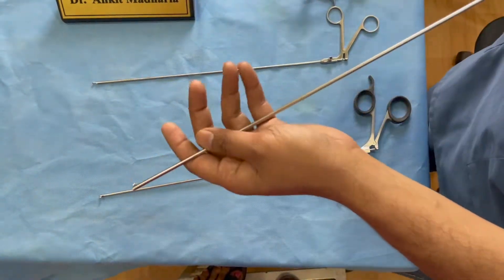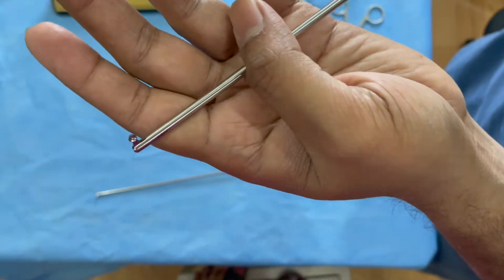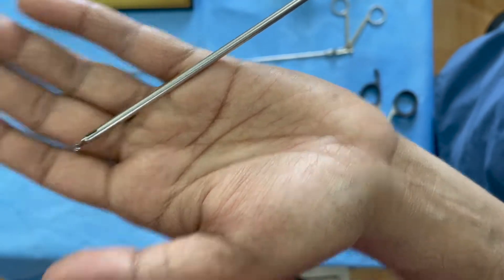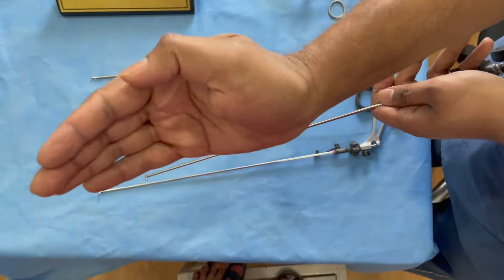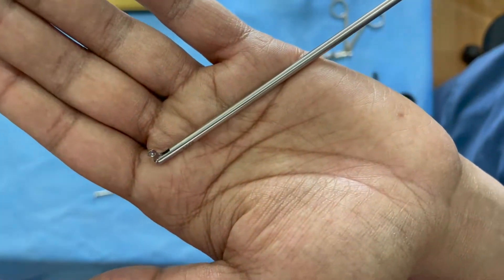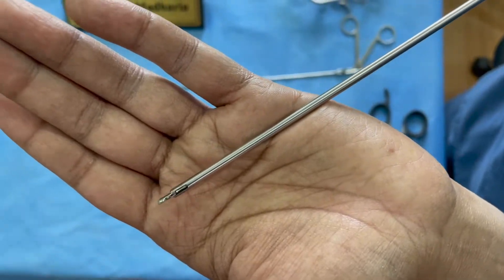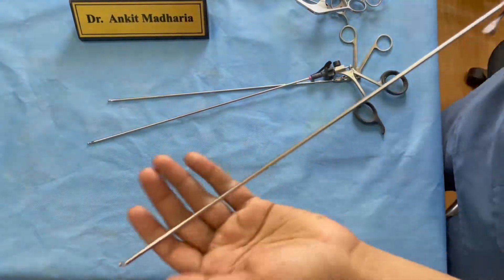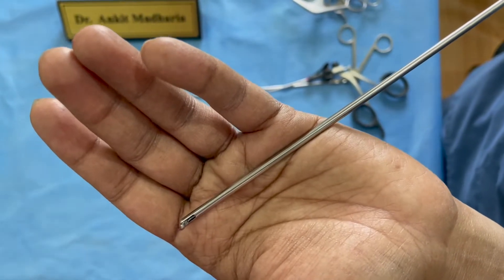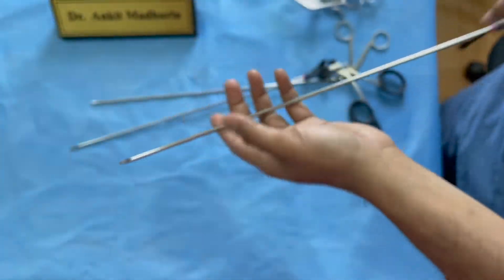The next kind of curette is a left articulating curette — the scoop faces the left side and it can flex to break osteophytes on the left side. You flex it and then turn it. Similarly, you can have a right-side curette. Having all three curettes — forward, left, and right — is very essential for stenosis surgeries where you will face a lot of osteophytes.